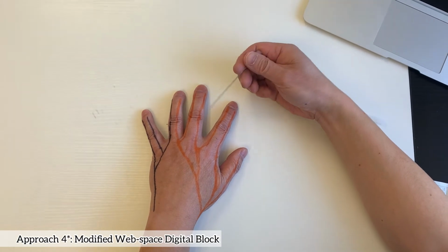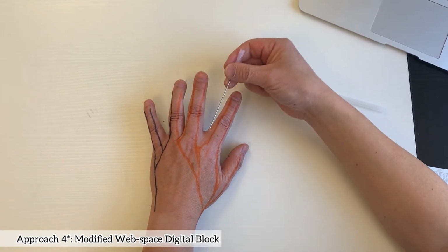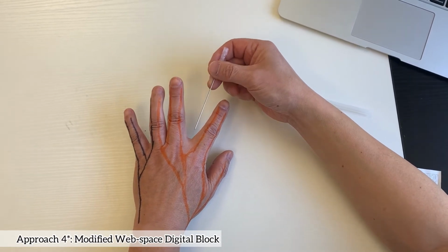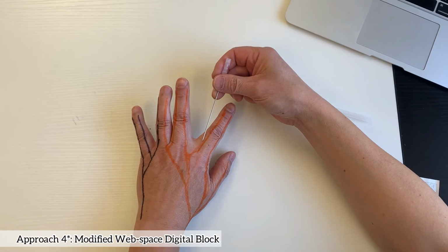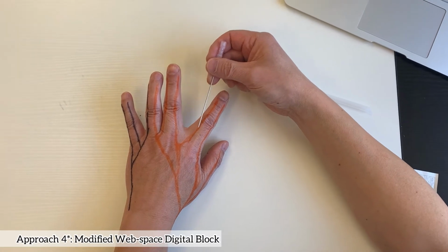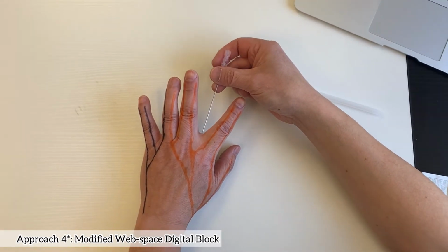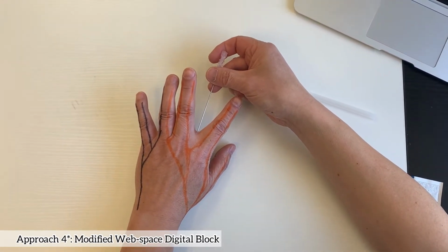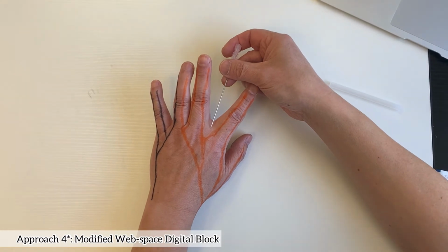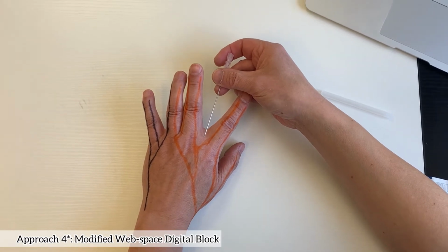Now I'm going to talk about the modified web space approach. Your needle entrance is parallel to the hand at the web space, and you inject local anesthetic. There is a superficial transverse ligament, another word for which is swimmer's ligament. Once you make the skin wheel, advance the needle 5 to 10 degrees to the ulnar side, aim at the edge of the ligament, and inject 2 to 3 cc of local anesthetic.